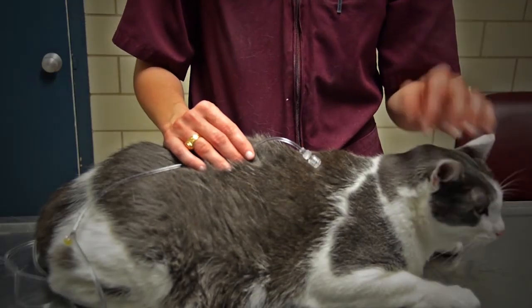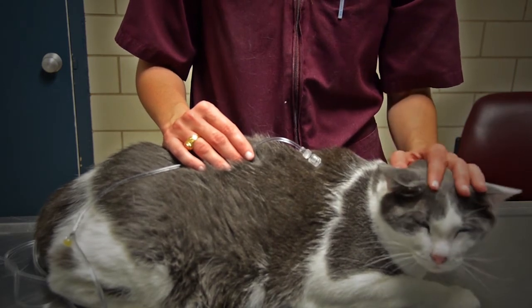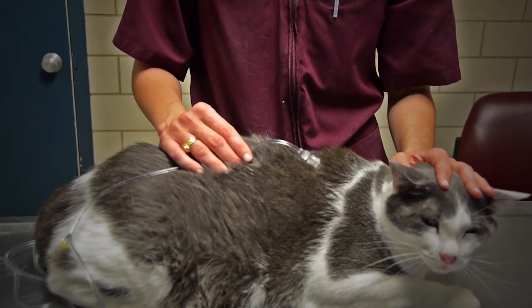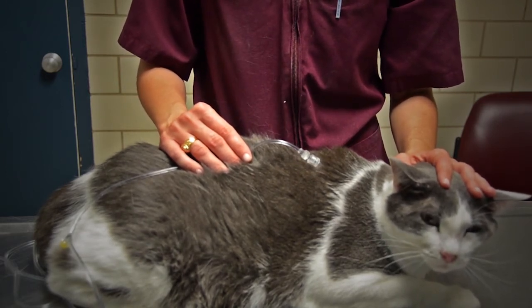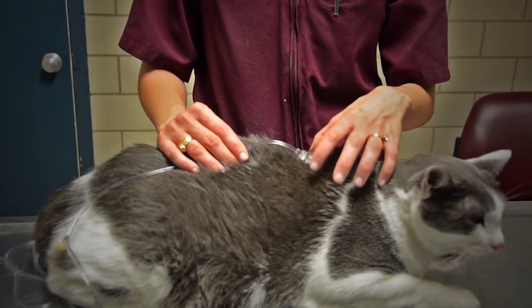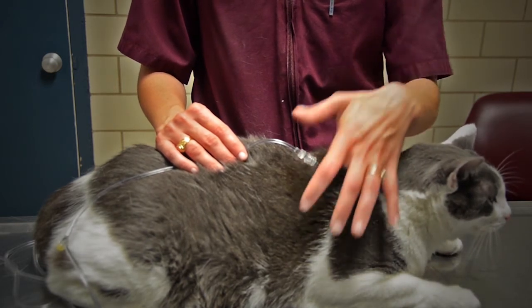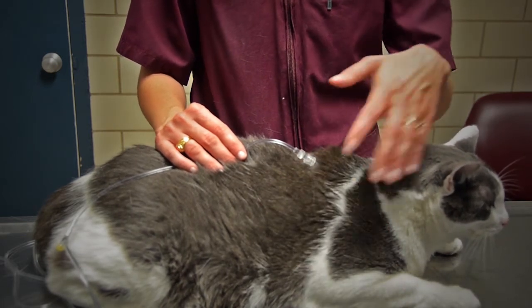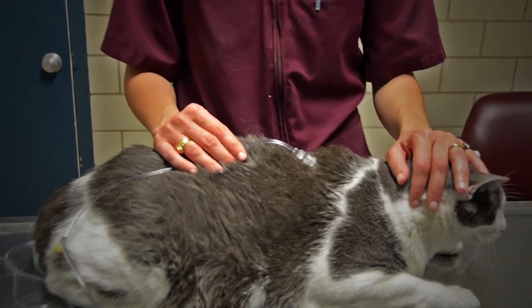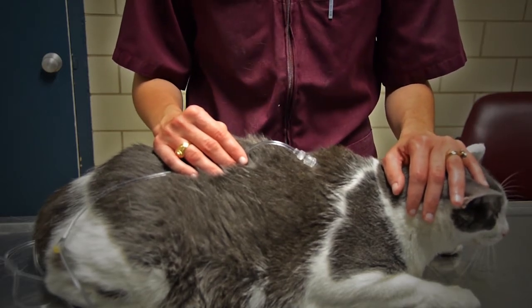He is a kitty, and his chronic kidney disease is pretty mild, so we're only going to give him 100 mLs today. So his bag is starting at the 6, and we're going to go down to the 7. After administering the fluids, you'll see a small ball form in this area. That ball can be gravity dependent, and it may go down on either side and sometimes even become a little bag of fluid in the leg. That's totally normal. If it hasn't absorbed completely in 24 hours, that's not as normal and something we would want to know about.